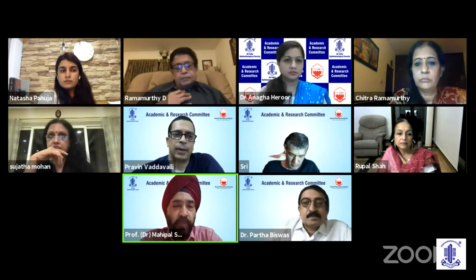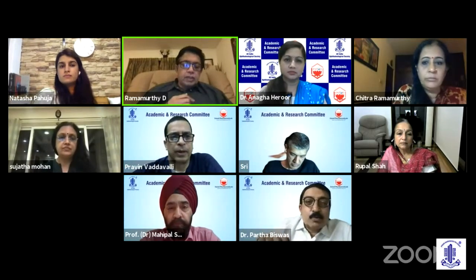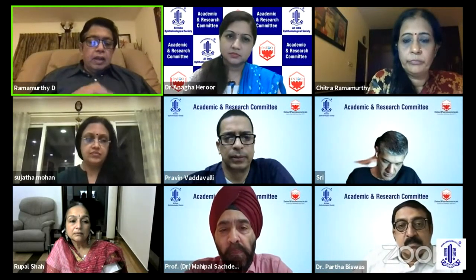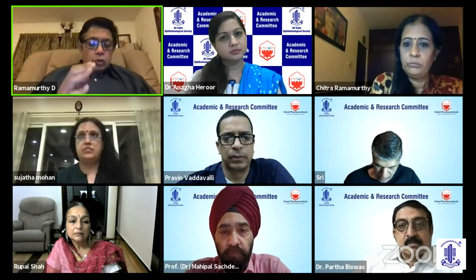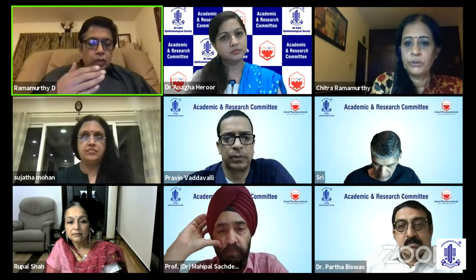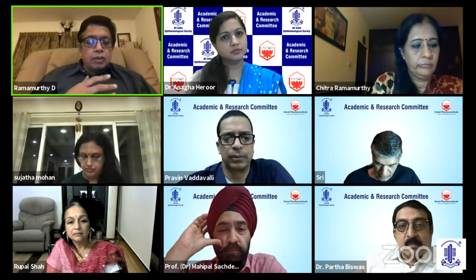But I have never had a problem in case I have been aggressive enough to treat these stria and do them the way I normally do them. Just an observation. Post-SMILE, as Dr. Mahipal mentioned, the striae do not occur. But I have found some wrinkles, especially if you have removed a high-power lenticule. And this is more because of wrinkling at the Bowman's level. So routinely nowadays, after removing the lenticule, I hydrate and then do a certain amount of ironing from up to down, about 8 to 10 times. I do find that this gives a more pristine cornea and better visual acuity on post-operative day 1.